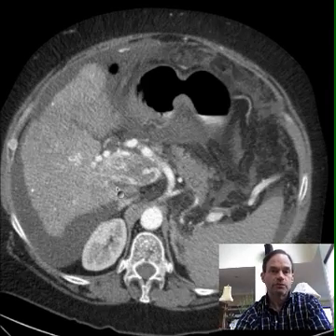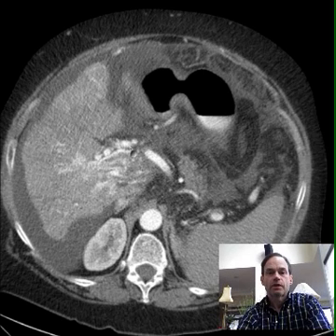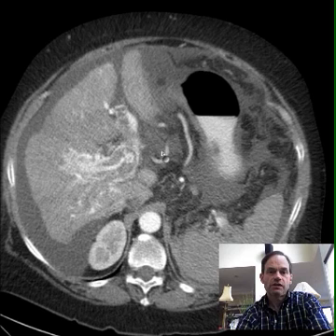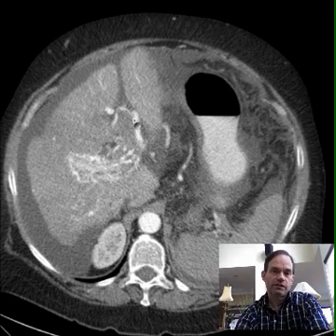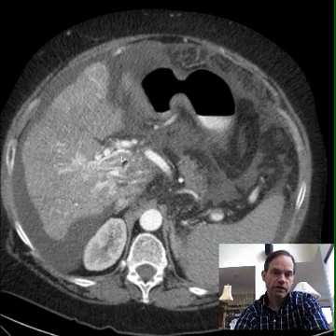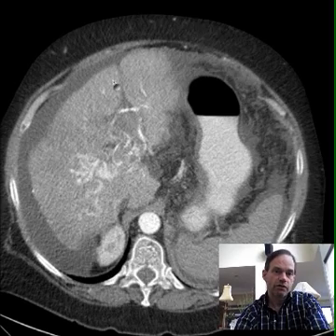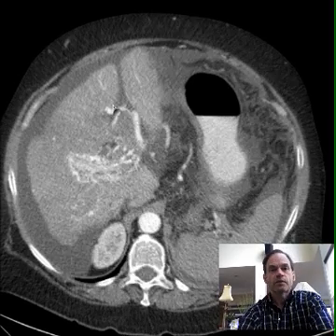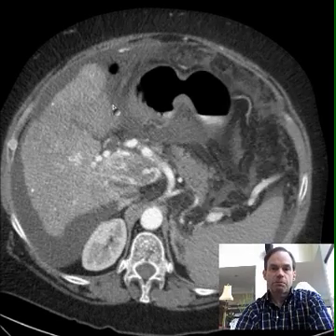Now follow this up toward the hepatic hilum, the portohepatic area, and you'll see that the thrombus goes not only into the main portal vein, but also extends up into the left and right main portal vein. Here it is extending up into the right portal vein, and then if you go up farther, you see it going into the left.